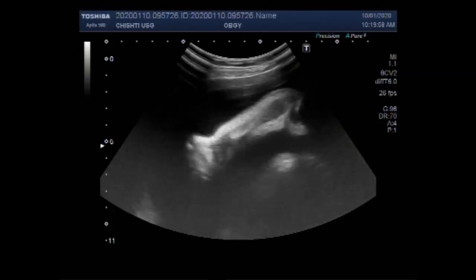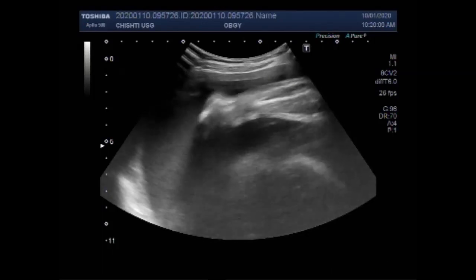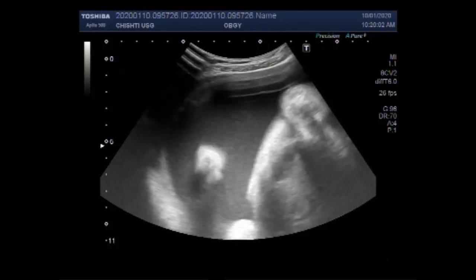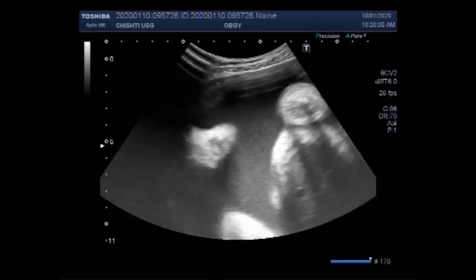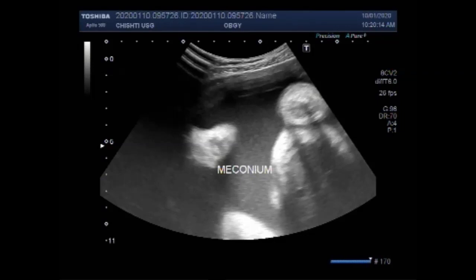These are the limbs, and fetal cardiac activity and fetal movements are also seen. Blood flow was also demonstrated. Meconium is seen in the liquor amnii.